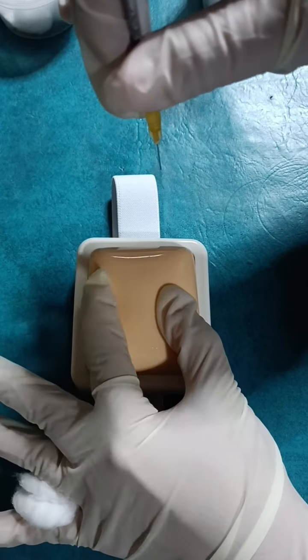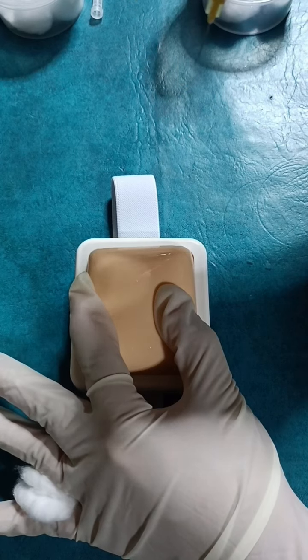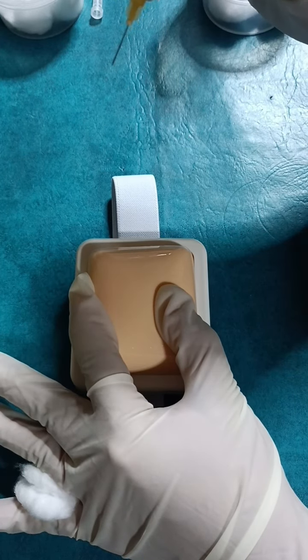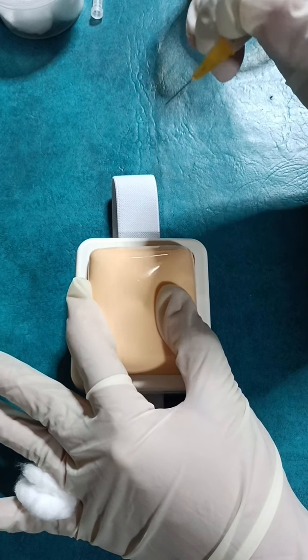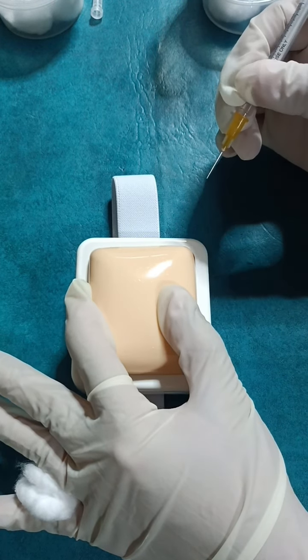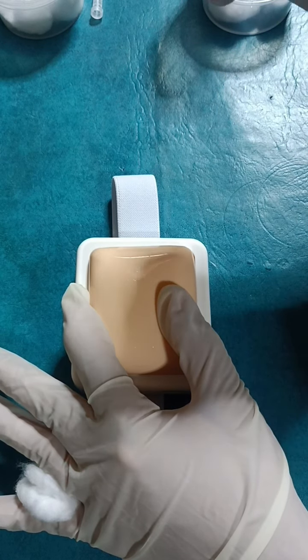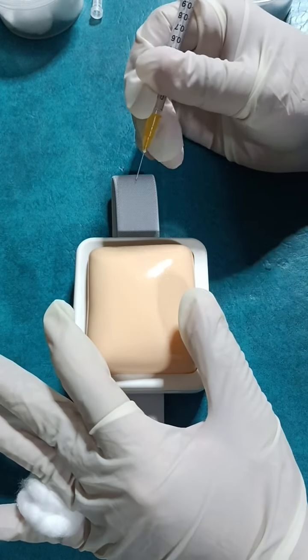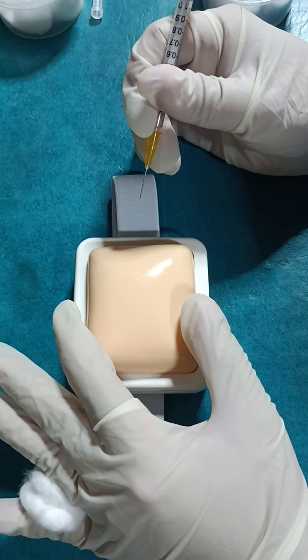If the client is thin or lean and lacks adipose tissue, the subcutaneous injection should be given with the skin pinched, at a 45 to 60-degree angle. One way to check that you pinch only the subcutaneous tissue is to ask the client to flex and extend the elbow. If any muscle is being held in the pinch, you will feel it contract and relax. If so, release the pinch and try again.